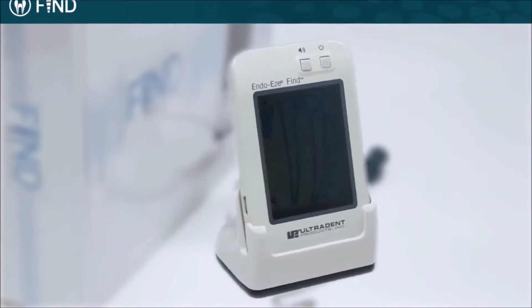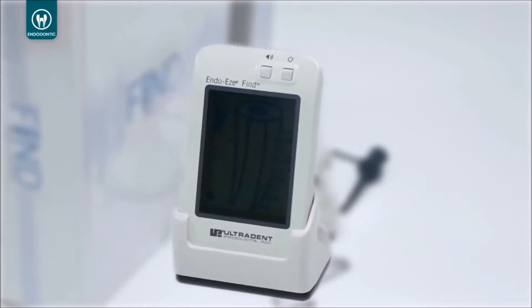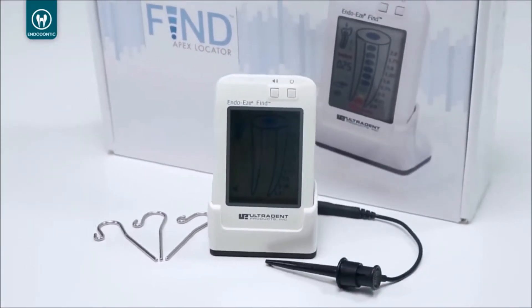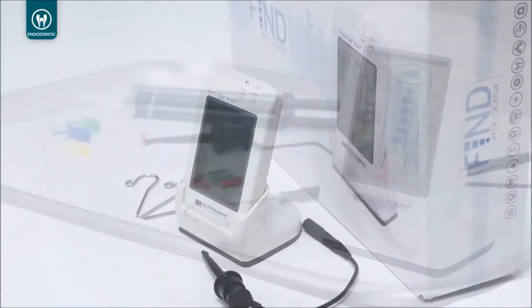The EndoEase Find Apex Locator uses fully automatic multi-frequency measurements to provide unsurpassed accuracy and reliability with a convenient and easy-to-read display, and its compact design and small footprint allow it to fit easily on a counter or treatment tray.